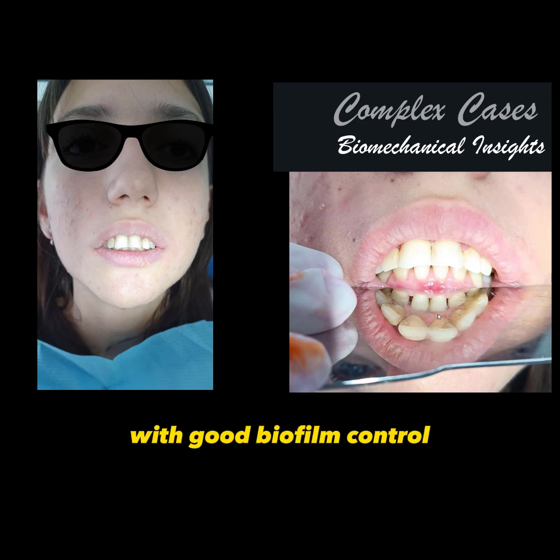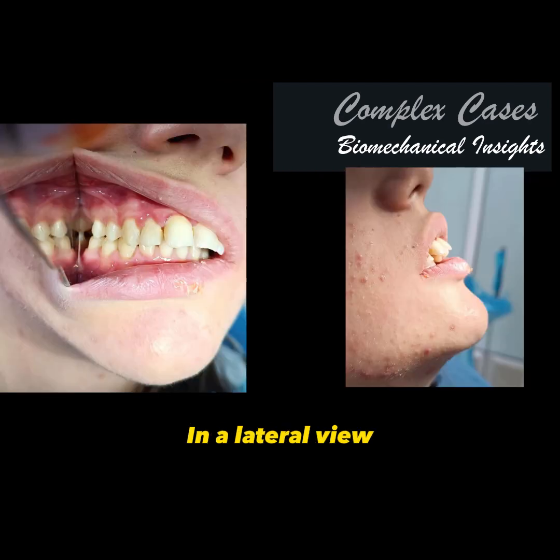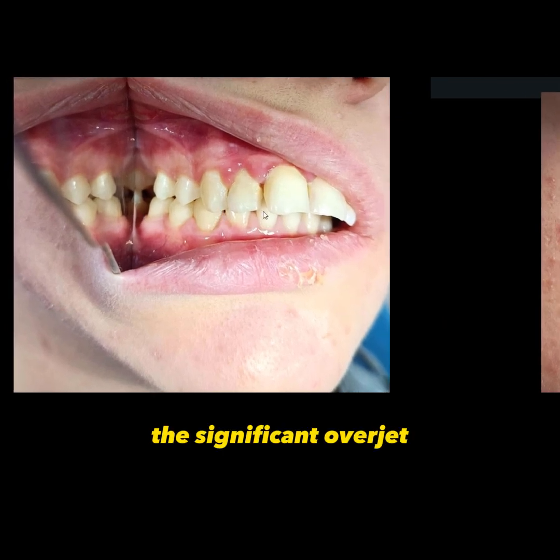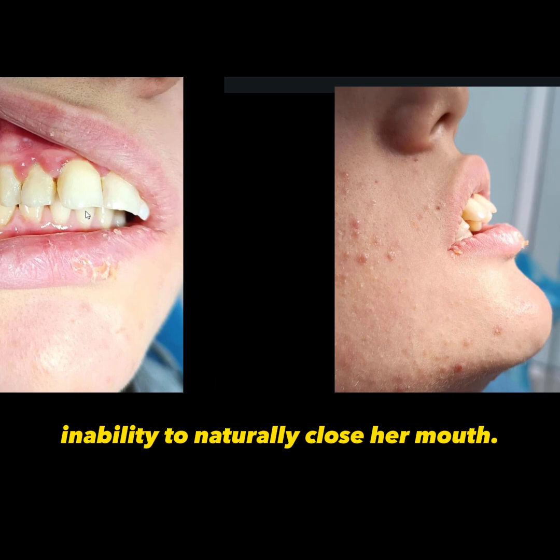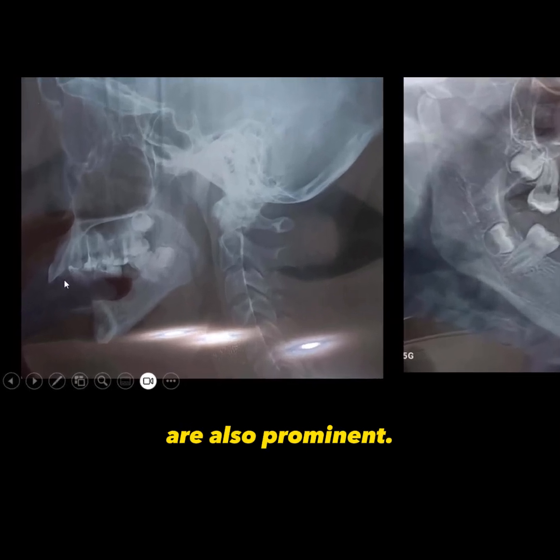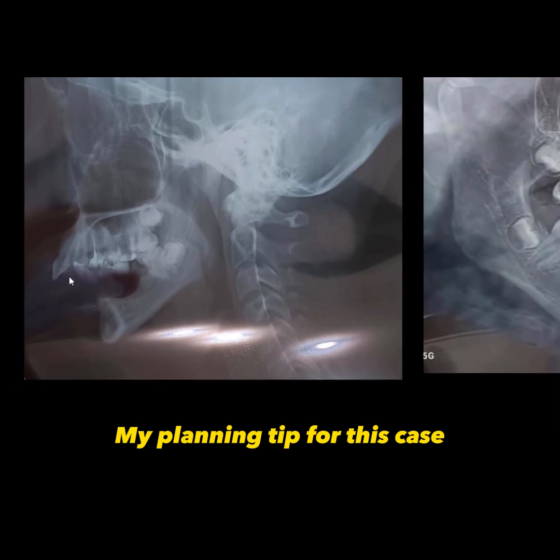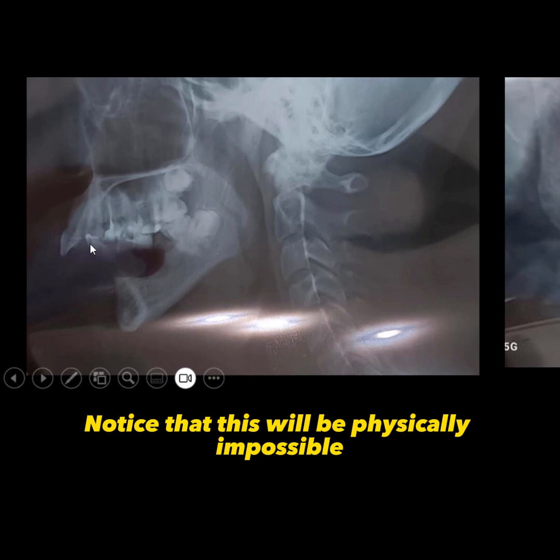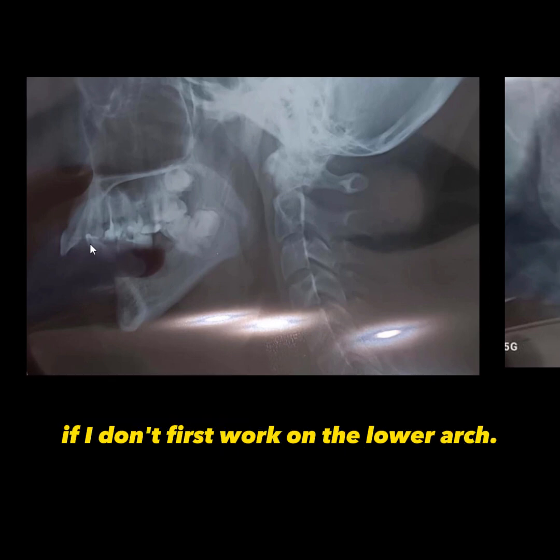Treatment can only proceed when the periodontium of these teeth is healthy, with good biofilm control and no bleeding. In a lateral view, we can observe the Class 2, the significant overjet, and the patient's inability to naturally close her mouth. In the radiographic images, the significant overjet and overbite are also prominent. My planning tip for this case is the retraction of the upper anterior teeth.